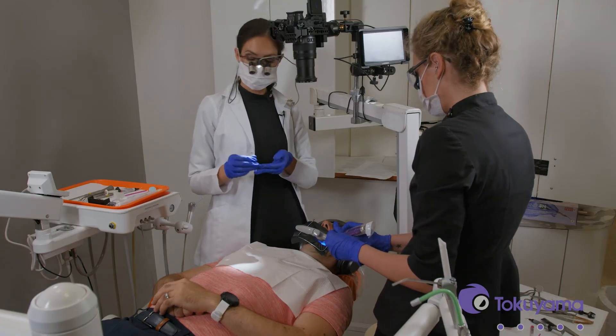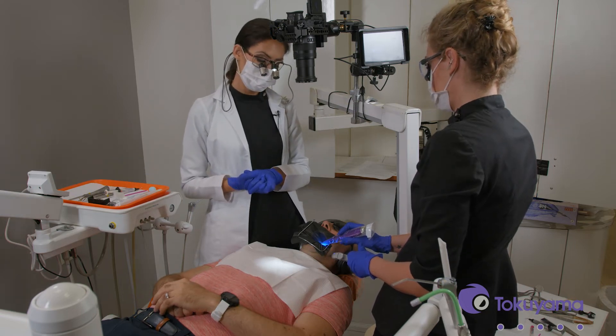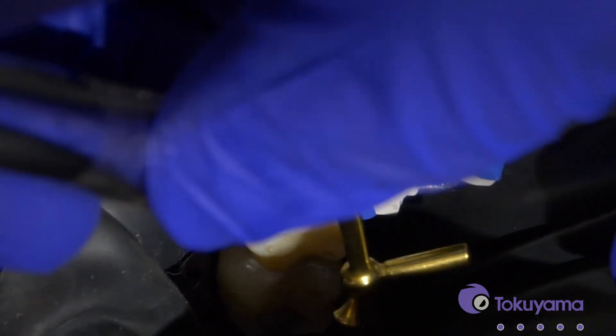With the Omni Chroma product you do want to apply it in two millimeter increments. You can see when you apply the Omni Chroma product it does look white, and that's really helpful because you can see it very well. But once you cure it, don't worry — it's going to turn into tooth color.